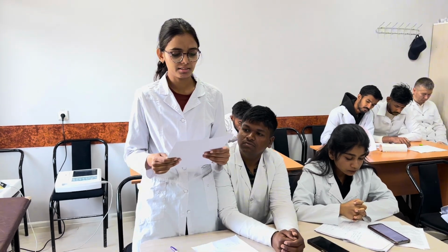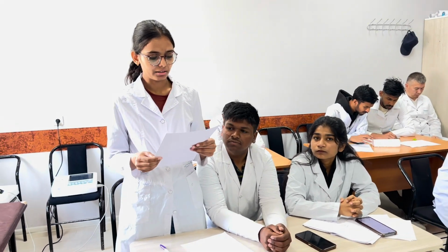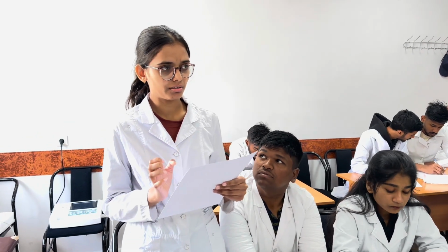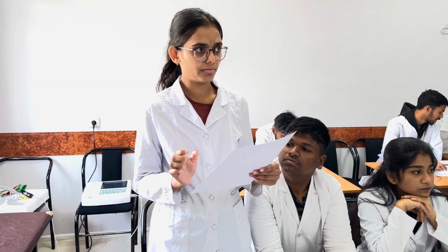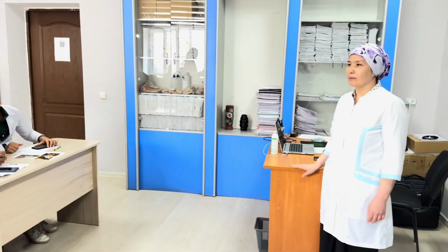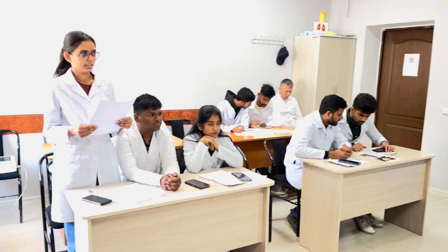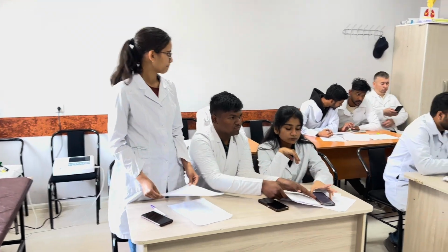Ma'am, here we can see reduction in the RR interval, and we also see a tall T wave, ST segment depression in V2, V3, V4 leads, and a narrow QRS complex, and the heart rate is more than 120. So it says the condition of sinus tachycardia. Okay, do you agree, guys?